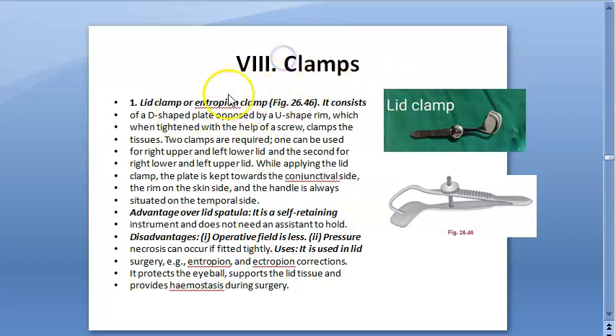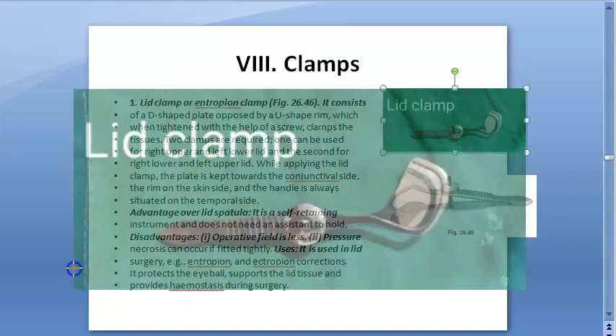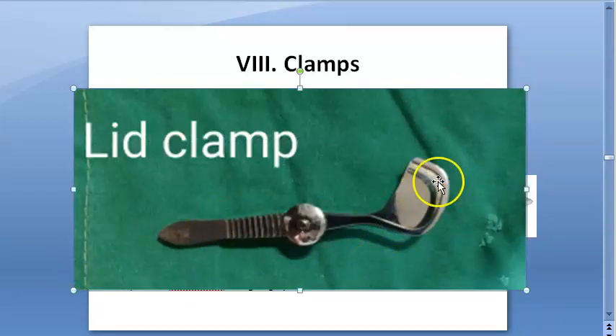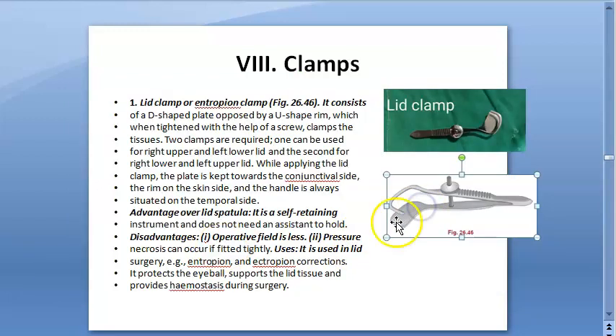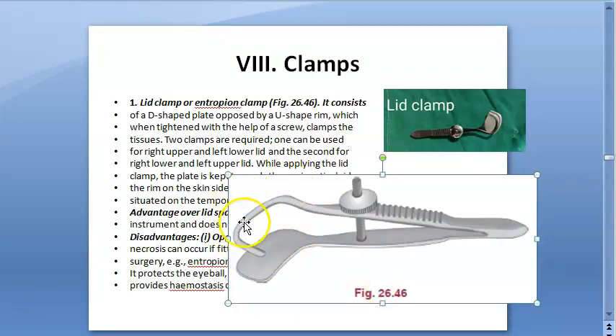Let us look at the lid clamp, or entropion clamp. So basically, you want to fix the lid. Just see how it looks. It has some D-shaped plate here, and above it there is a U-shaped rim. A D-shaped plate opposed by a U-shaped rim — this is a lid clamp.